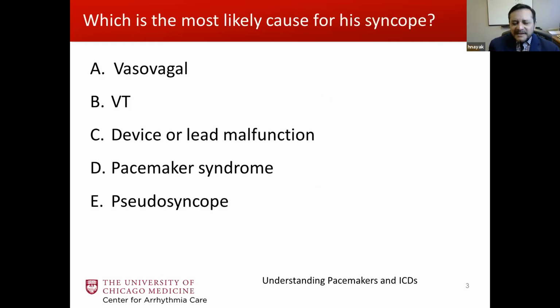Generally speaking, the most common etiology for syncope after pacemaker implant is neurocardiogenic syncope for 2 reasons. One is that sometimes pacemakers are put in for neurocardiogenic reasons, and for the most part, pacemakers really don't prevent neurocardiogenic syncope. The other possibility is that neurocardiogenic syncope is the most common cause of syncope. And a lot of these patients who get pacemakers are also on vasoactive medications, making them at risk for hypotension. It's always easy for the emergency room to blame the pacemaker. Oh, it's the pacemaker, it's not working. The chances of pacemaker failure are extremely low.